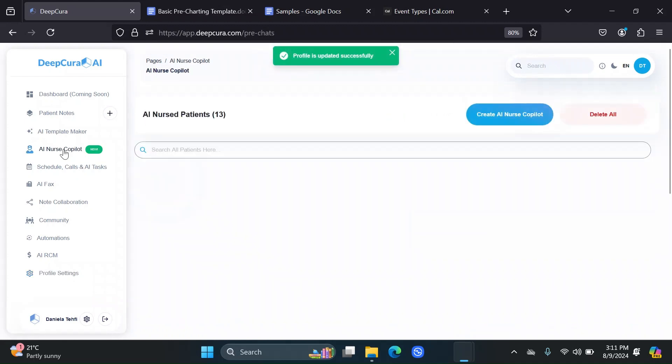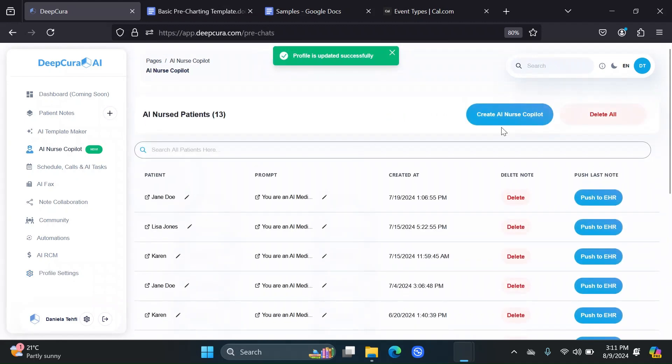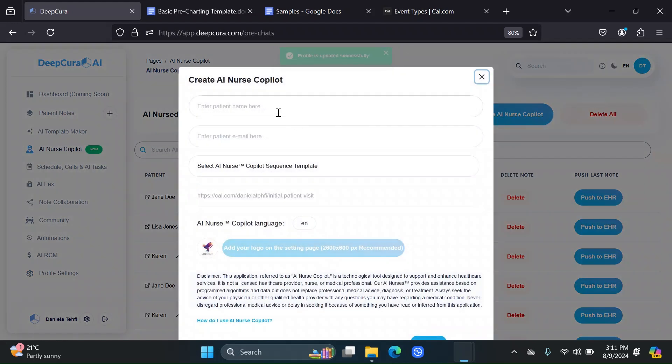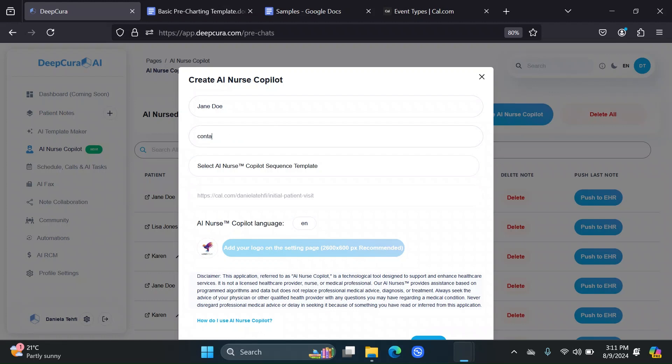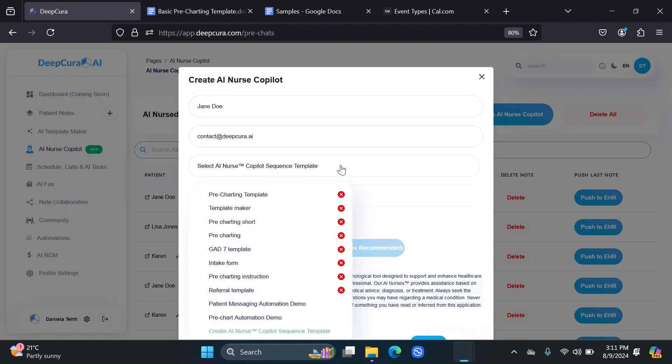If we go to AI Nurse Copilot and create an AI Nurse for, let's say, Jane Doe, then we put in Jane Doe's email and we select an AI Nurse Copilot Sequence Template. What exactly does this mean?